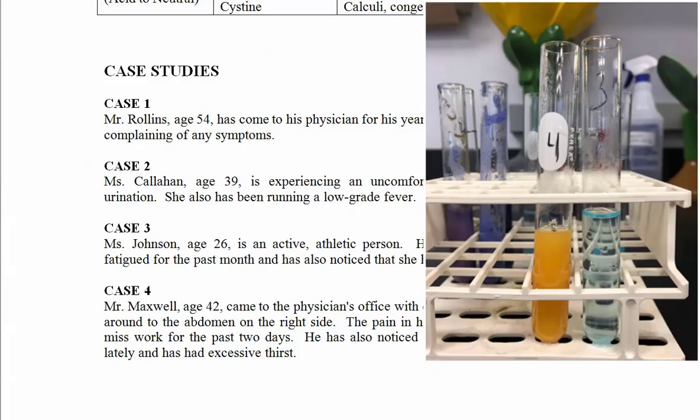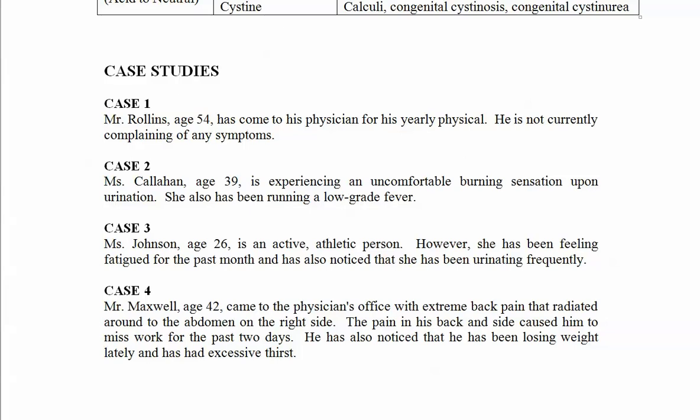So if somebody has glycosuria, in other words, they have glucose in the urine, we would be able to detect that with Benedict's. And as you recall, if you put the light transparent blue solution in, it will turn a green, yellow, orange, or red color depending on the amount of sugar. And if you've got a lot of sugar in there, it'll turn bright red, anywhere in between green through yellow and orange.